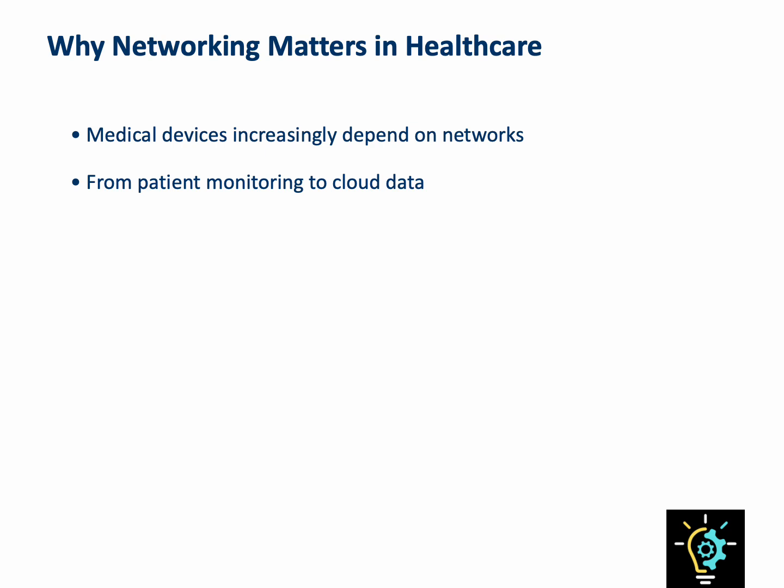For example, an ECG recorded at the bedside can be viewed by a cardiologist across town. A nurse may receive an alert from a patient's monitor directly on a handheld device. So these are not extra features. They are all central to patient safety and care.